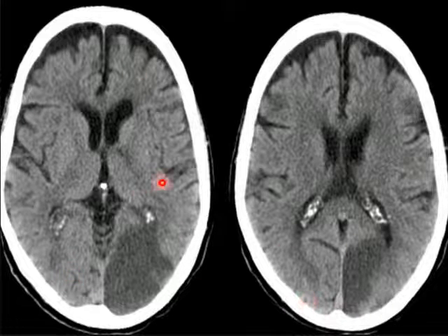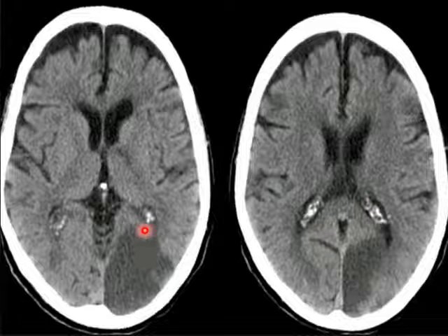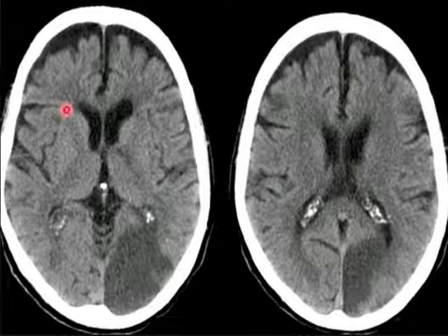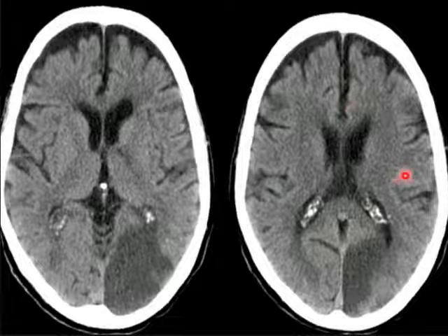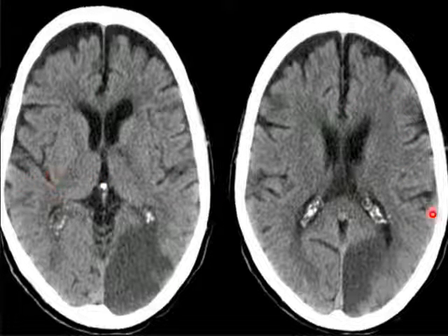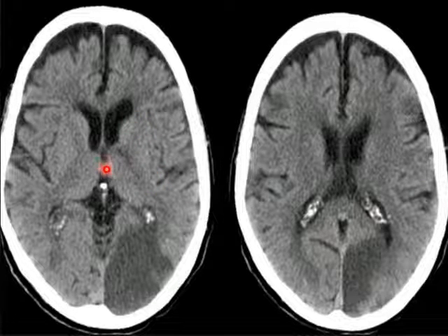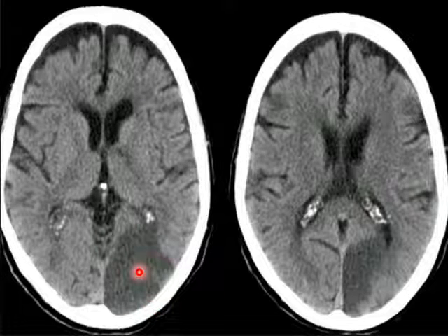Where is this lesion? It is a hypodense area. Where? Okay, this is at the level of the lateral ventricle, right? Line. This is the frontal lobe. Second line, this is the occipital lobe. And this is the temporal lobe, because this is the third ventricle. So it is infarction of the occipital lobe.